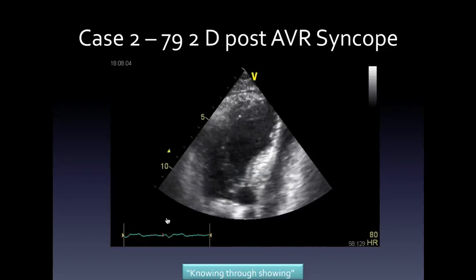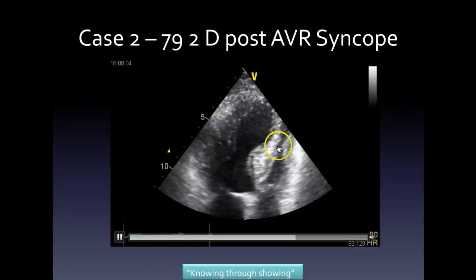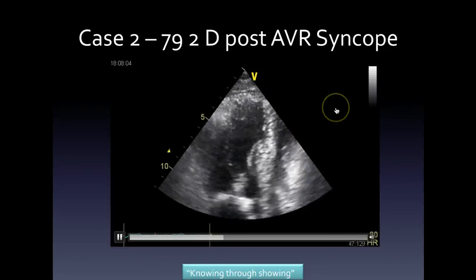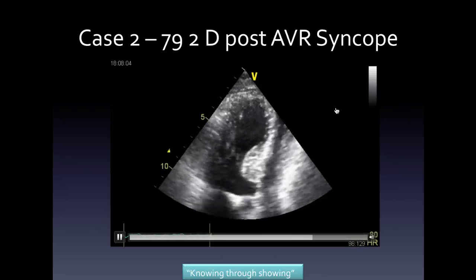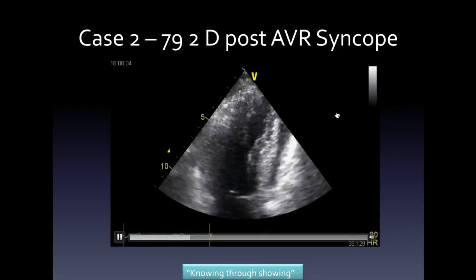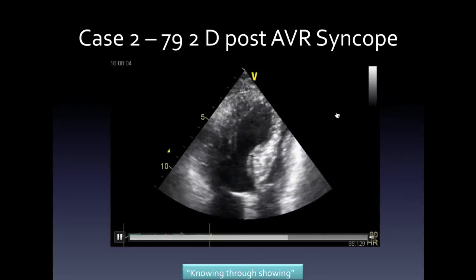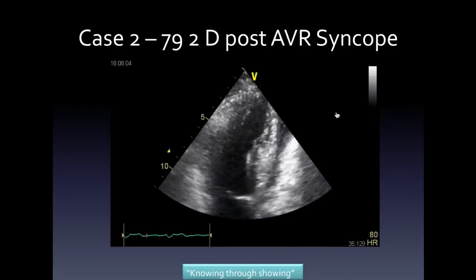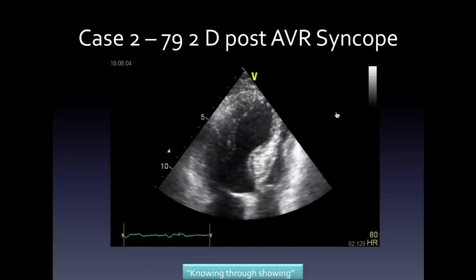Disconnected. Yeah, now that's a good point. So is it dyskinetic or dyssynergic? Dyssynergic. Yeah, it's a tricky one. The RV looks very small, and that's a very useful point to make. But this is not a real 4-chamber view, you see. If you haven't got the view, you're not going to really be able to comment on the right ventricle.